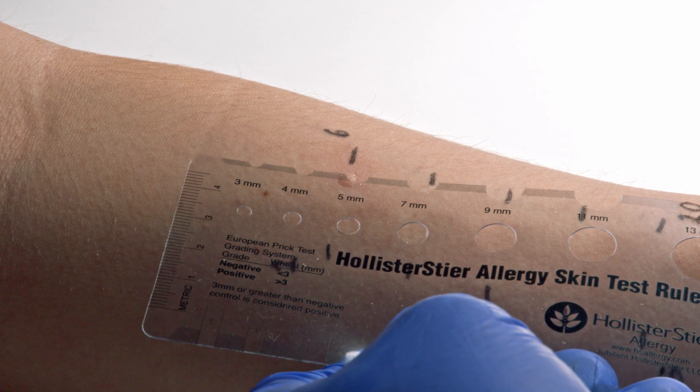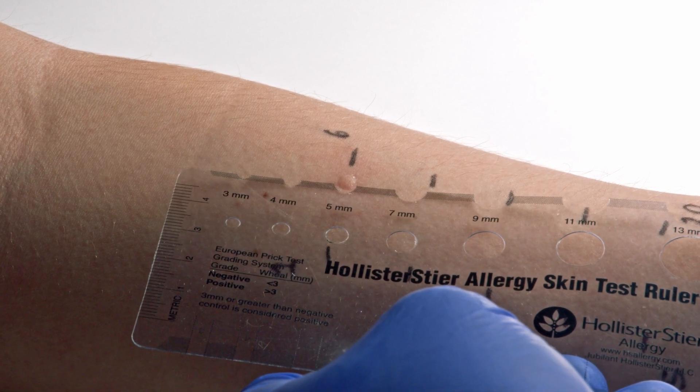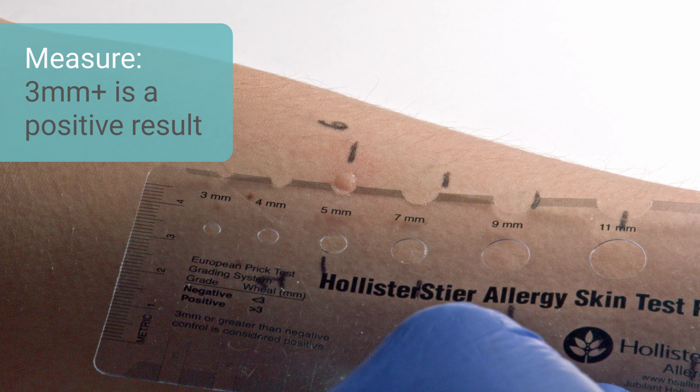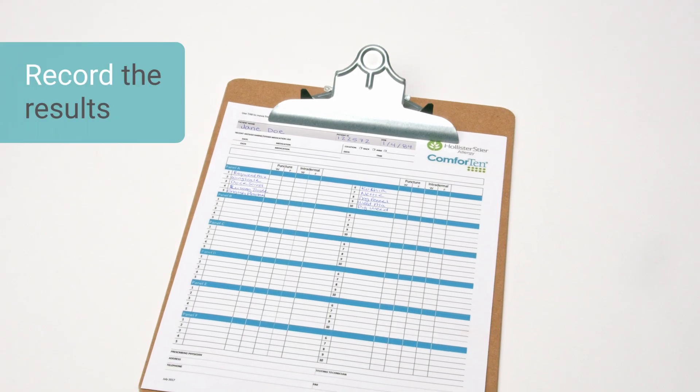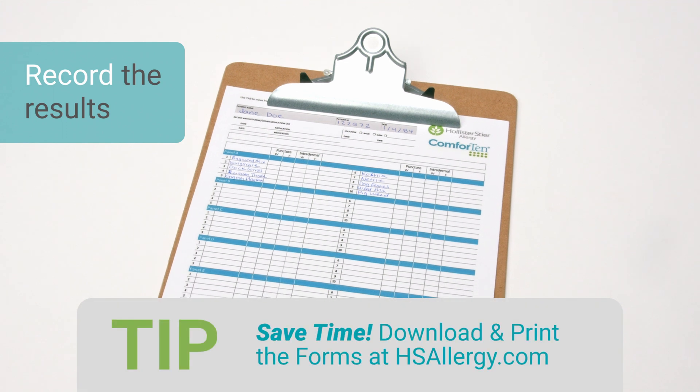Use the Hollister-Steer reaction guide ruler to read the results. A wheal of 3 mm or more indicates a positive reaction to the allergen. Record the results on the Comforten skin test record.